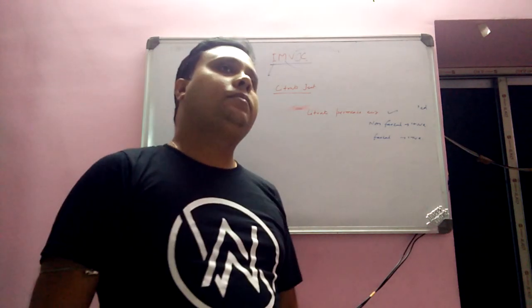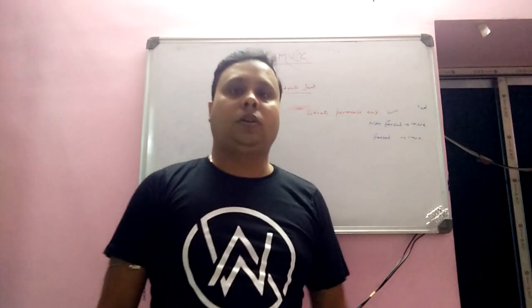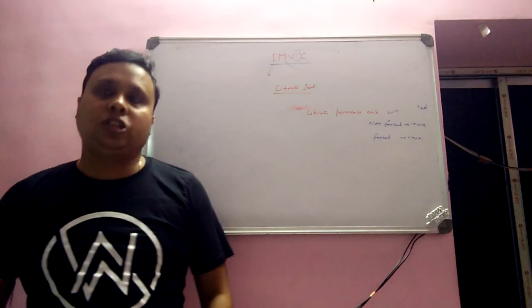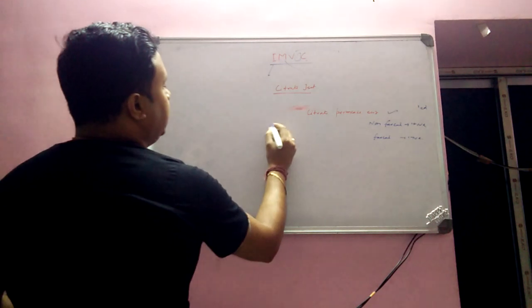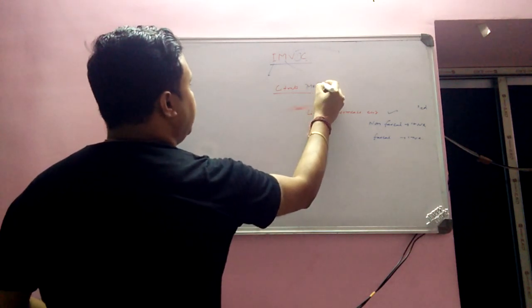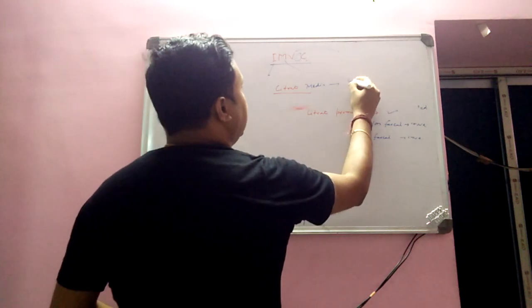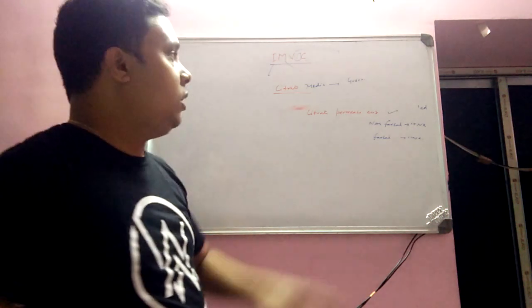One thing, in order to check better, you can use some kind of indicator in the media. The Koser citrate broth or Simmons citrate media, the color of the citrate media is green. So why is it green?